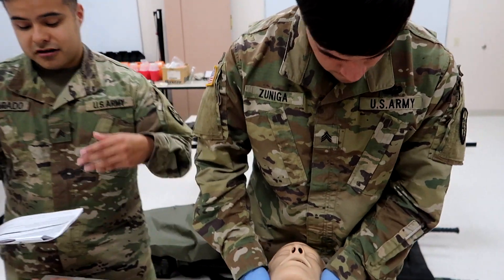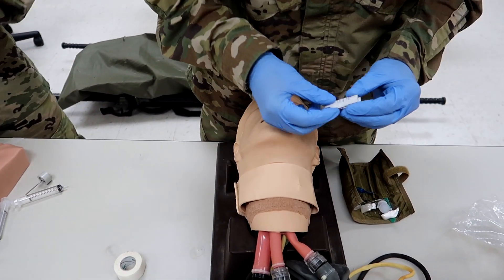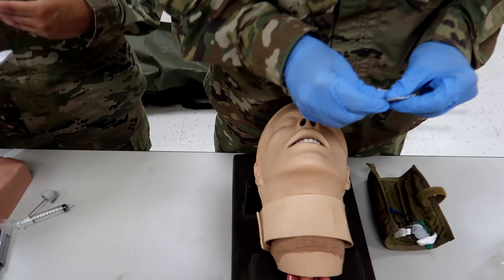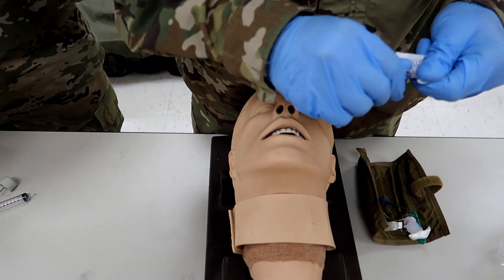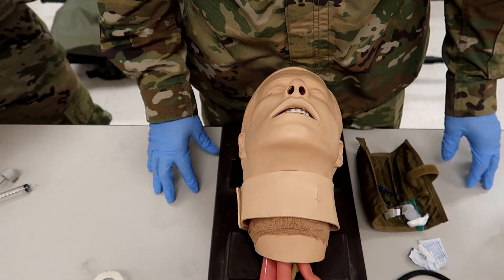All right guys, so here we are going to be reading off through the steps. As I read them, he's going to perform that individual step just to give you guys a general idea of what to expect. But again, listen to your instructors — they know how they're going to grade it. So take this with a grain of salt. Step one: take BSI.